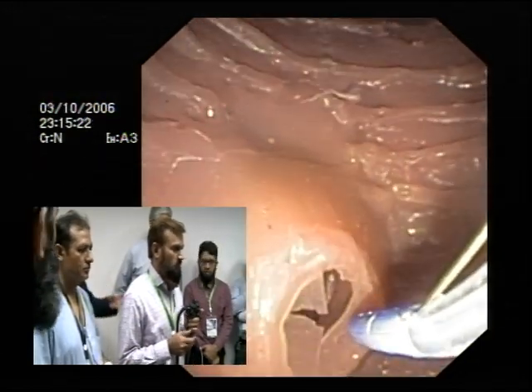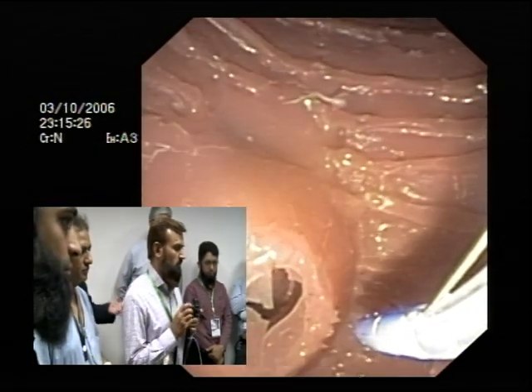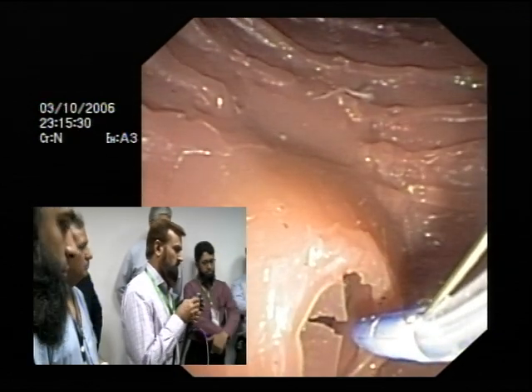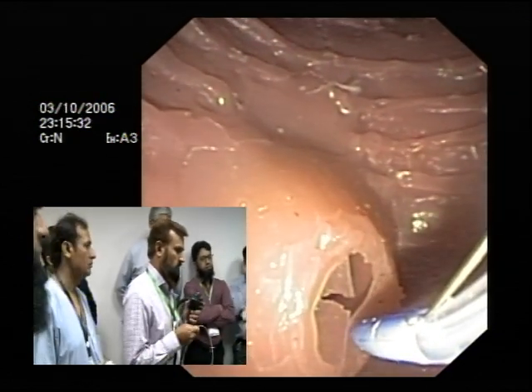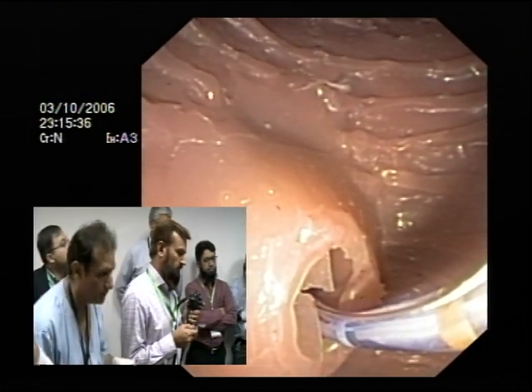And we are always in terms of the gut dancing on. As we are using conscious sedation, so there is no gut paralysis. So at all levels, while we position the ampulla, how much time should we spend before attempting the cannulation, and what are the points which we should look for?